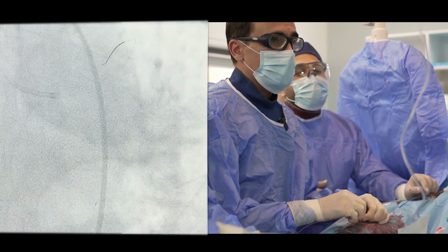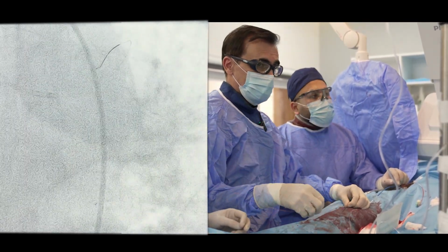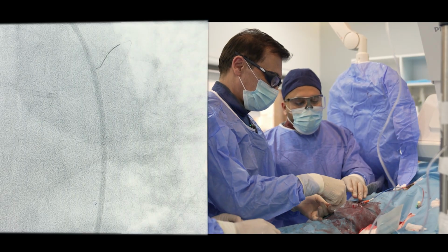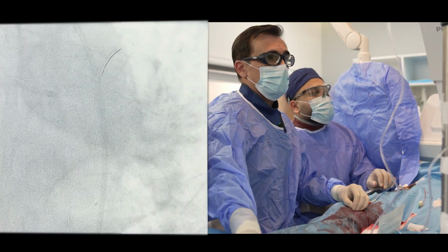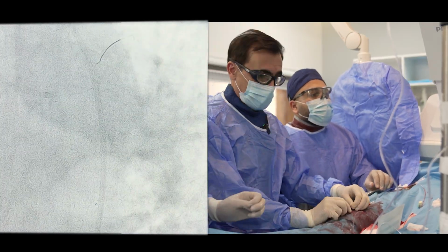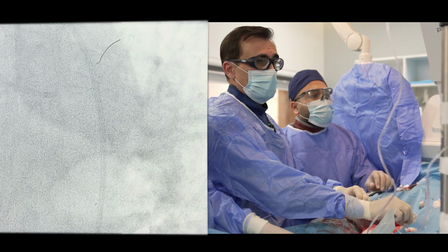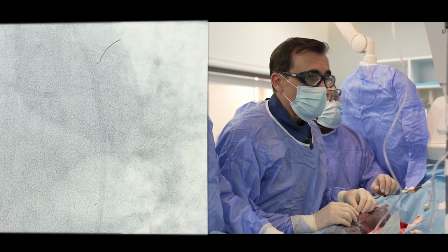Down. Yeah. Catching up the pressure, now recovering. It was 80, now around 100.